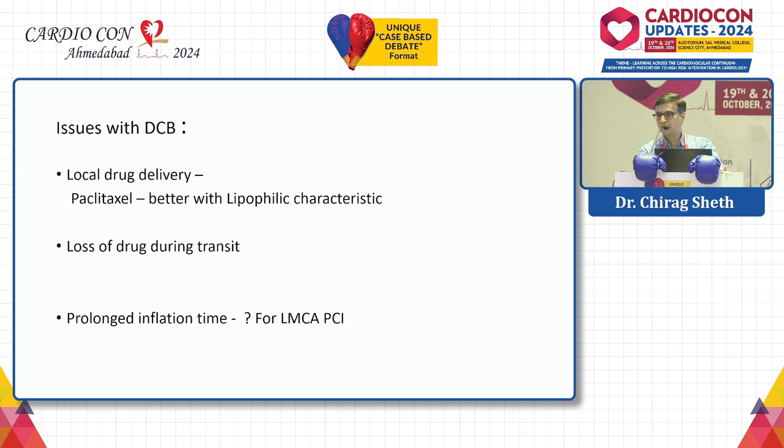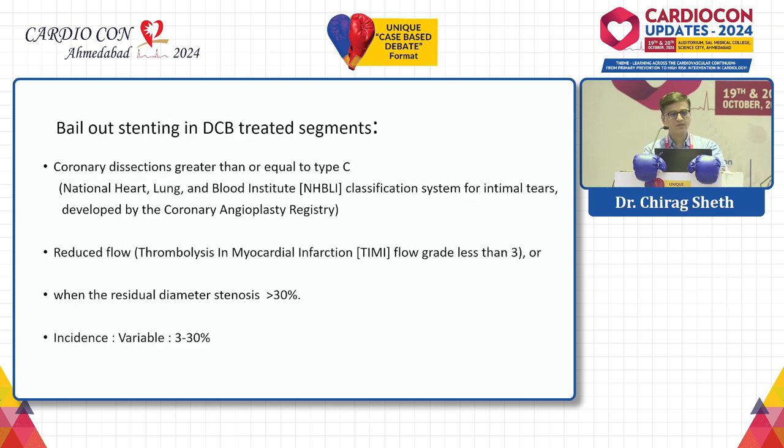Paclitaxel is supposed to be better because it has a lipophilic characteristic, and therefore the tissue delivery is better. Availability of local concentration is better in the event of delivering the drug with a drug-coated balloon. Loss of drug during transit is always a concern, and this kind of anatomy requires prolonged inflation time for a left main PCI. So that is always a concern whether we should consider a balloon in this kind of anatomy.